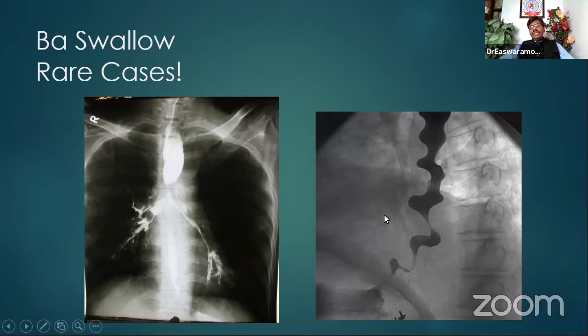Another common thing is a patient with severe recurrent retrosternal pain who has already visited 10 cardiologists. Atypical chest pain is diffuse esophageal spasm, wherein you can do a dynamic screen, as the patient drinks barium, with cinematography, one movie of the barium swallow.